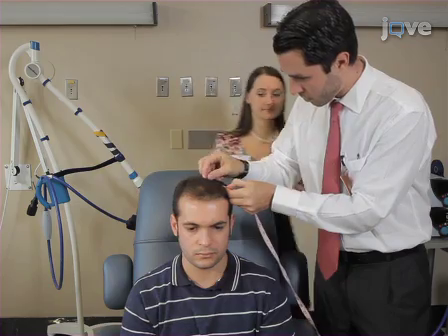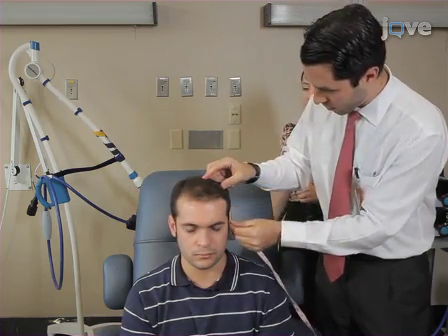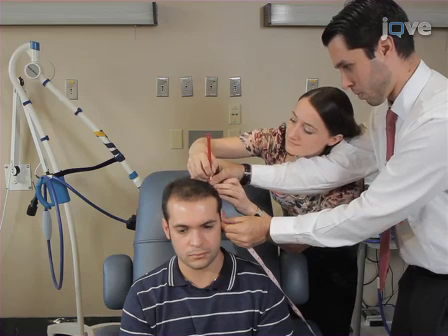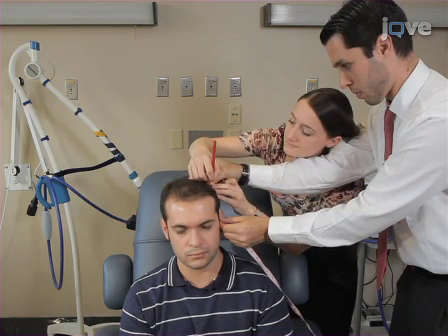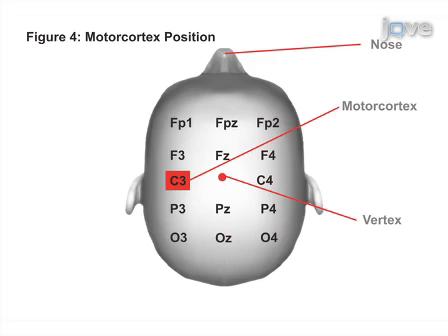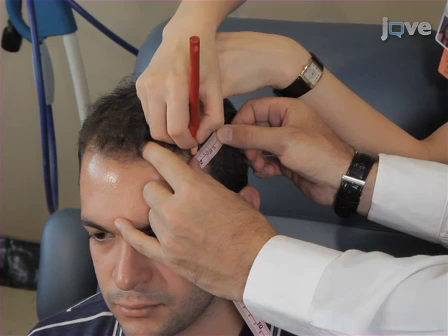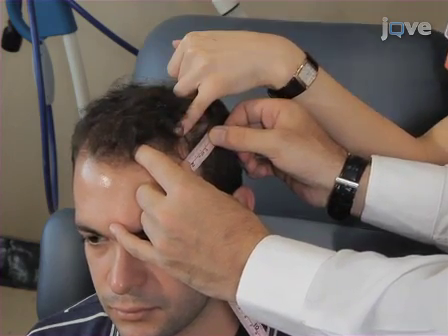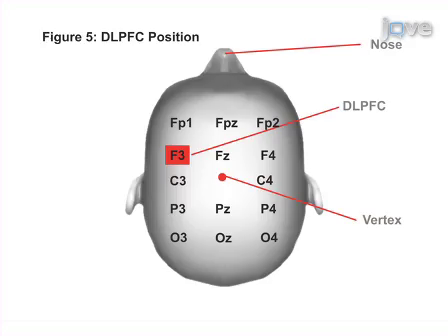To locate the primary motor cortex, or M1, calculate 20% of the auricular distance and measure this distance from the vertex along the auricular line. This spot should correspond to the C3 or C4 EEG location, and this is the location that will be stimulated in this video. To locate the dorsolateral prefrontal cortex, measure 5 cm forward from the M1 location. This should correspond to the F3 or F4 EEG location, as seen here.